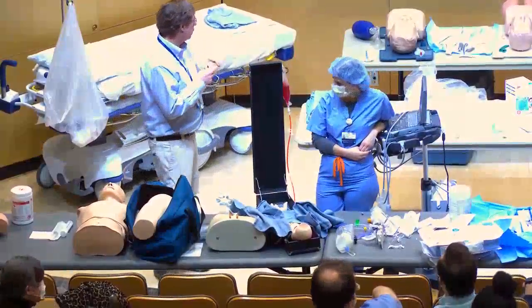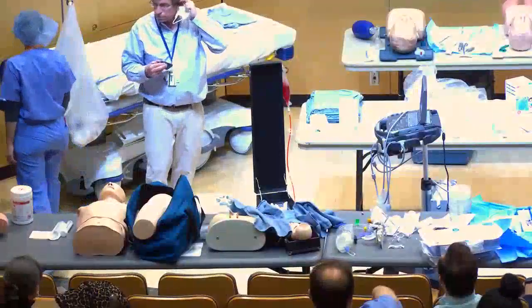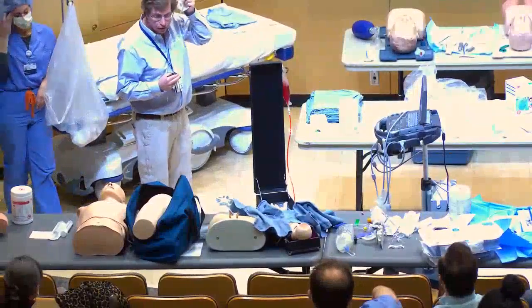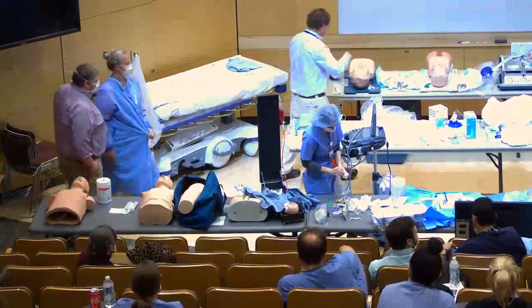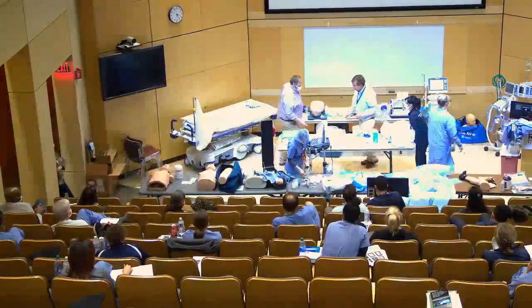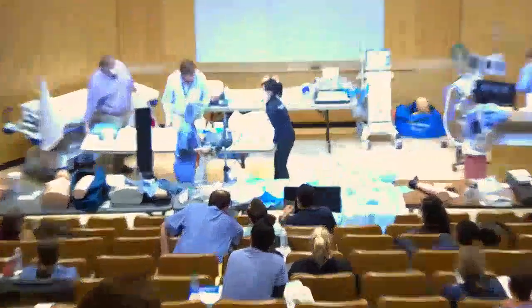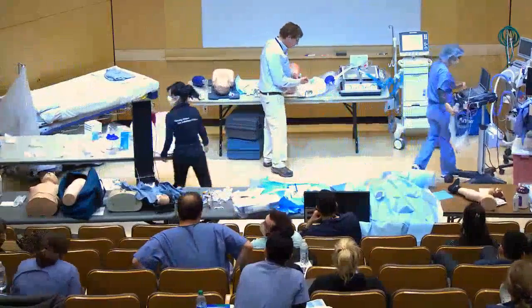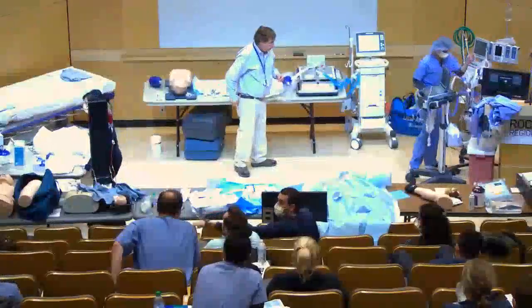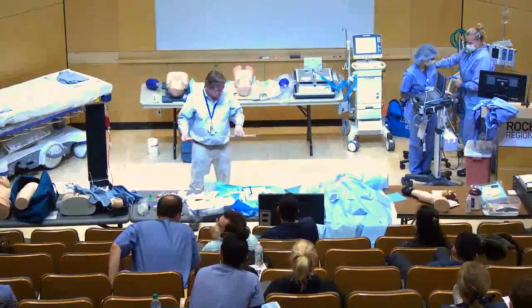We'll move on to intubation. We'll be using the GlideScope because that's the recommended approach for intubating COVID patients. Let me show you the bougie first.